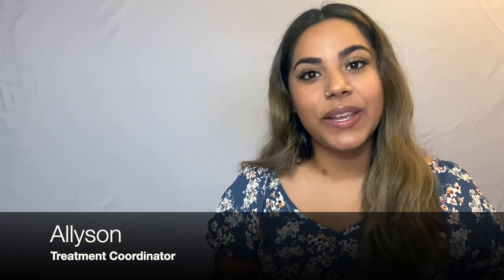Hey guys, Allison here. I'm so excited to get you going with your phase one journey here with us. Within this video, I will be going over what your appointment will look like and also what to expect once your palatal expander has been placed. I'll also be teaching you how to turn the key and how to do your virtual checks. Now let's get started.